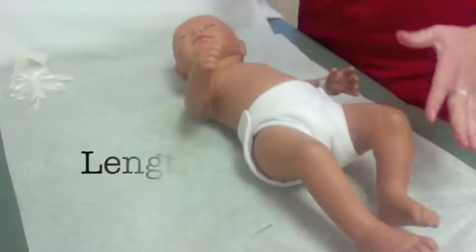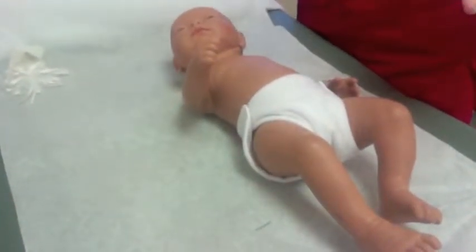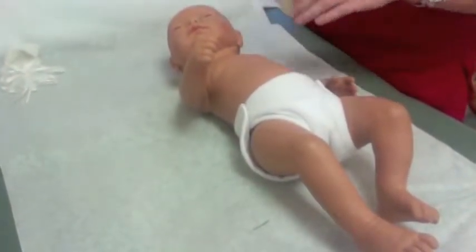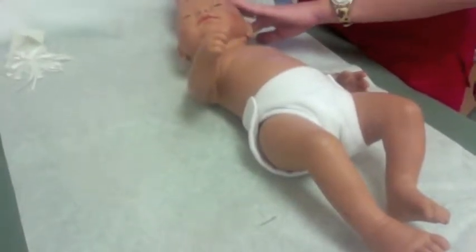You measure the baby in three parts: the length, the weight, and the head circumference. So we're going to measure the baby's length right now. You're going to want to remove the baby's clothes when you do measurement. That way we get more accurate results. So you're going to take the pen and you're going to mark on the parchment paper on the exam table right above the baby's head.